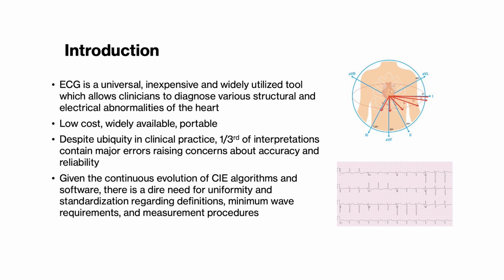But one of the key things that I have learned as I have been looking through is that at least a third of the ECG interpretations that we perform are erroneous. And I'm sure in multiple studies it's been shown. A lot of these interpretations are comparing primary care physicians as well as cardiologists. Whereas if you look at the cardiology community specifically, about 9 to 10% of the interpretations are inaccurate. And so this gives you a little bit of pause for thought.